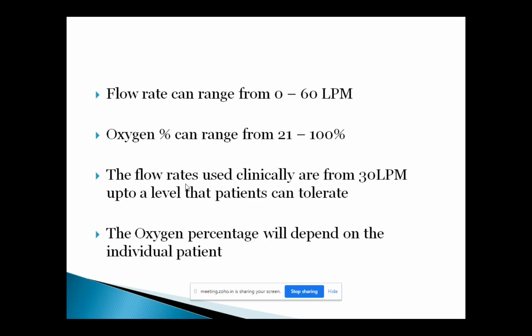of a month. So they will be able to give you the equipment, they will set the equipment up for you, they'll give you all the things needed. You do a 1 month trial or 2 months trial, it depends on how much you need. Then you can collect that evidence and really compare yourself. Is it really working? Are the patients improving? Then we are doing something right.